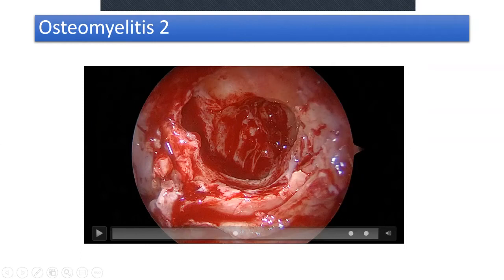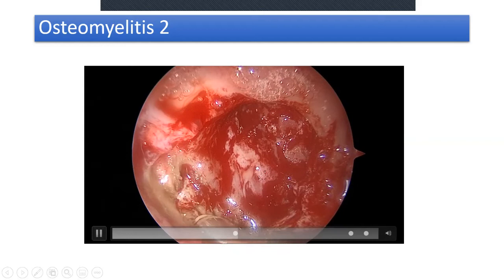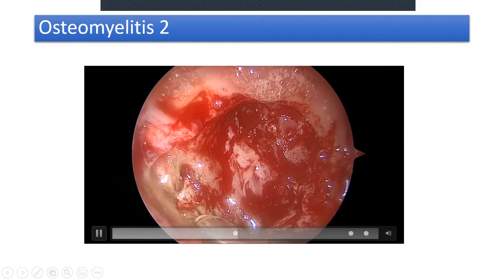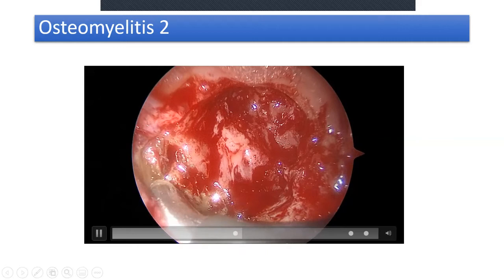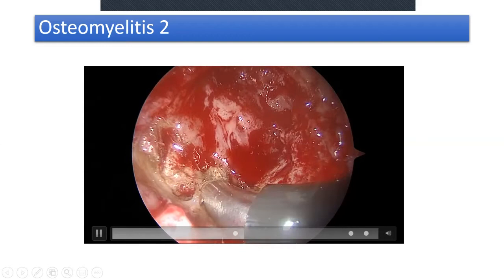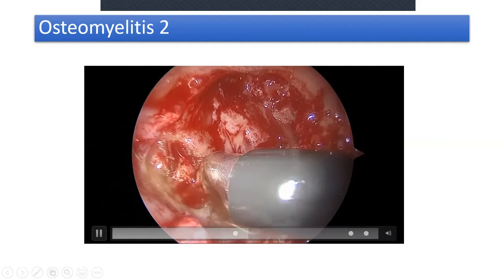Look at the cancellous bone quality — if you've done many maxillary sinusotomies, you know this is not the quality of bone in a normal maxillary sinus. See the porosity. In such patients, you would not want to keep this mucosa — this is diseased mucosa with the periosteum completely involved — and the best way to remove it is with coblation.